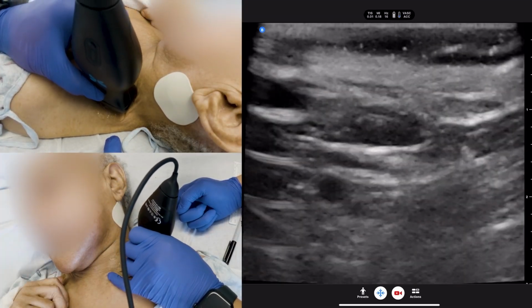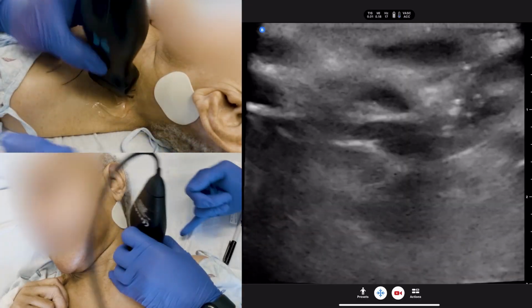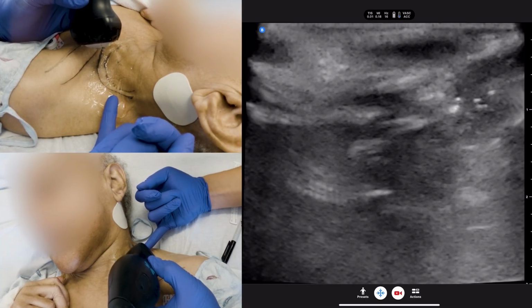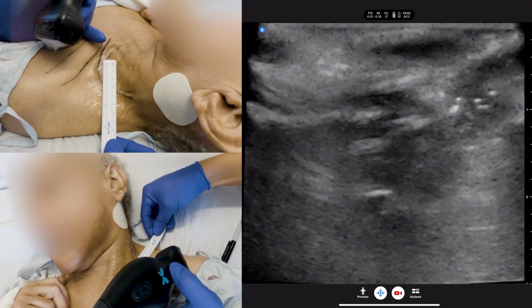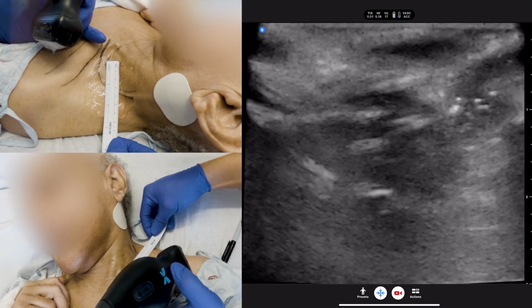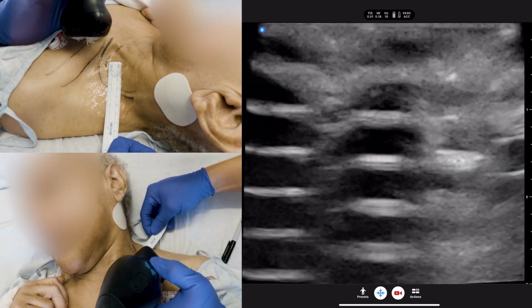Okay. And then we'll use the 6.4 centimeter angiocath. So what I'm going to do is start close to the IJ, right next to it, so I know that I'm not going to hit it. Actually, probably about 0.5 centimeter back, and then we're going to enter that way. And then we're going to 6.4. It's barely making it. With that angiocath, it can curve with the veins, so I think that's going to be the move. So we'll do that.